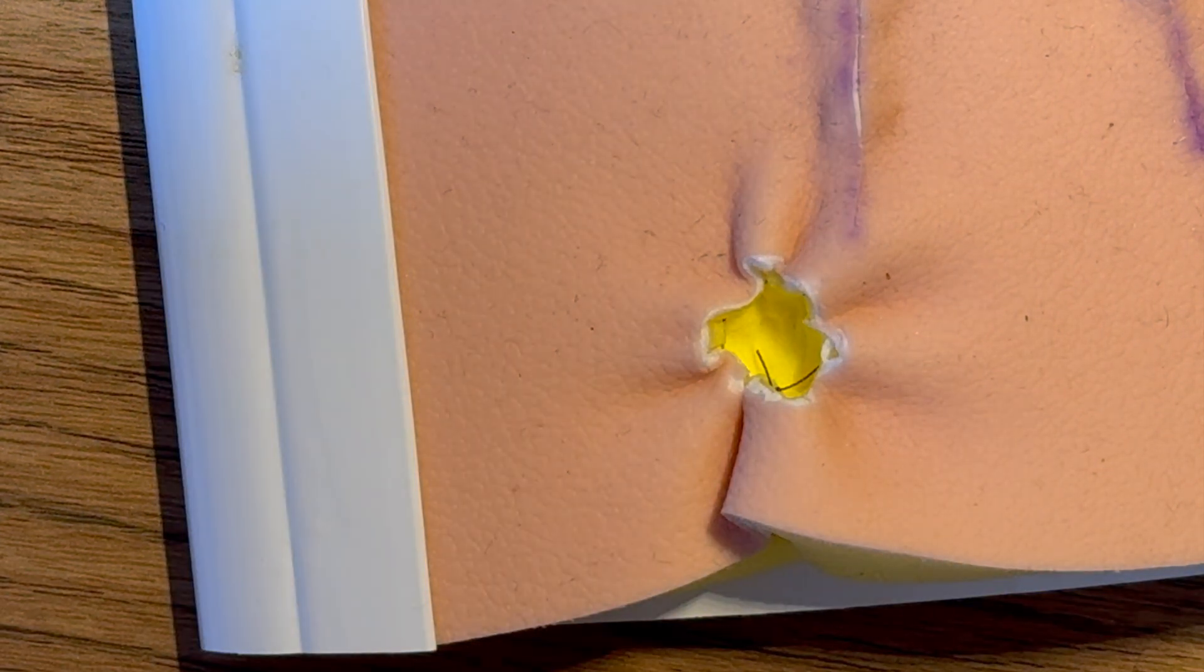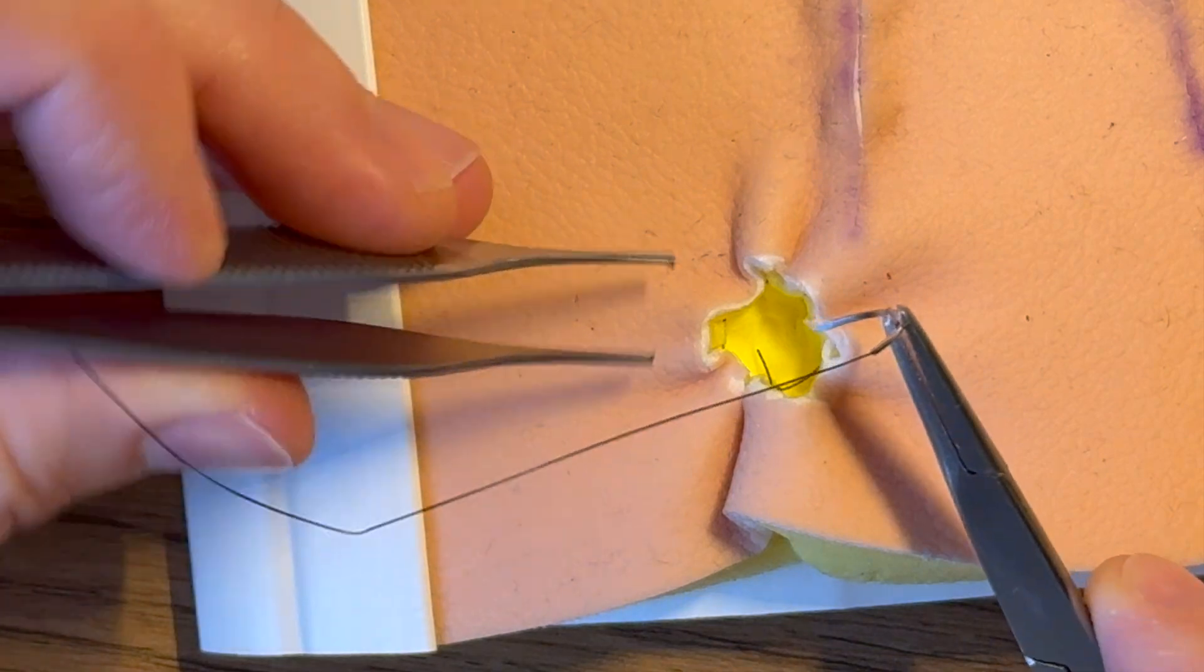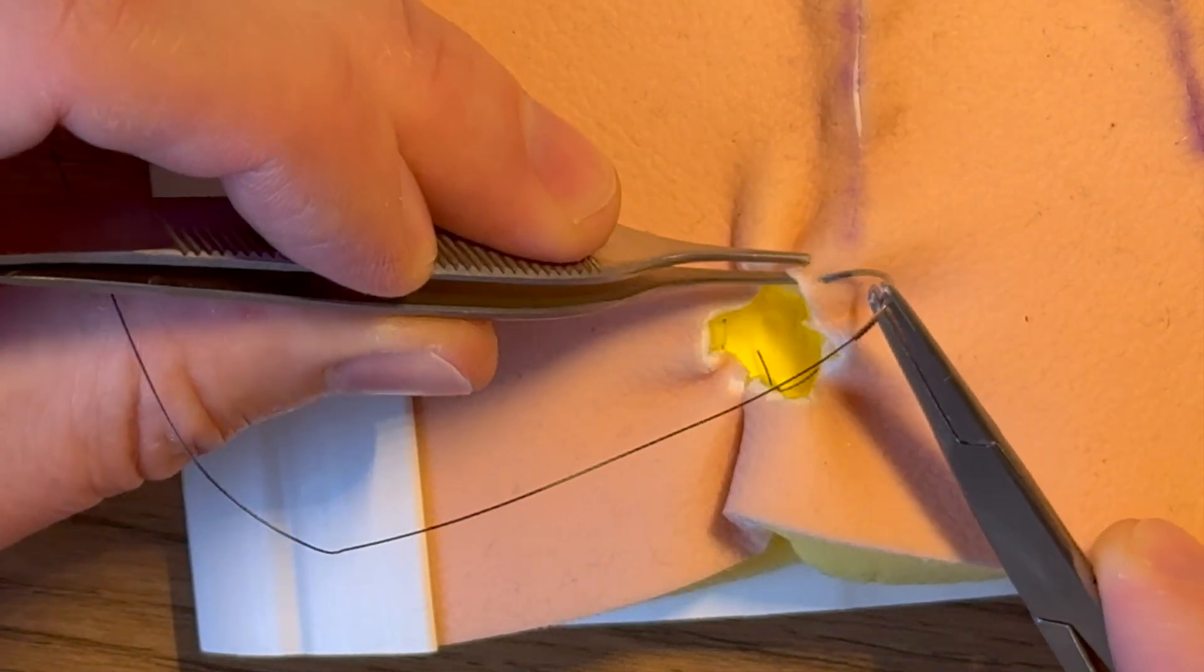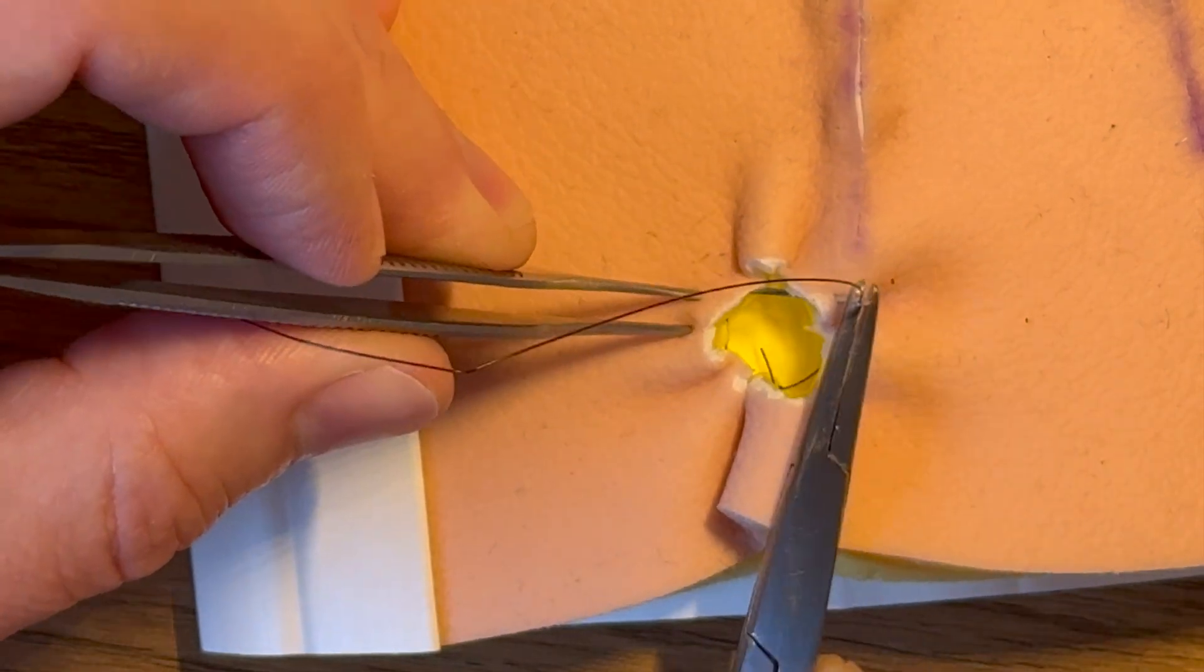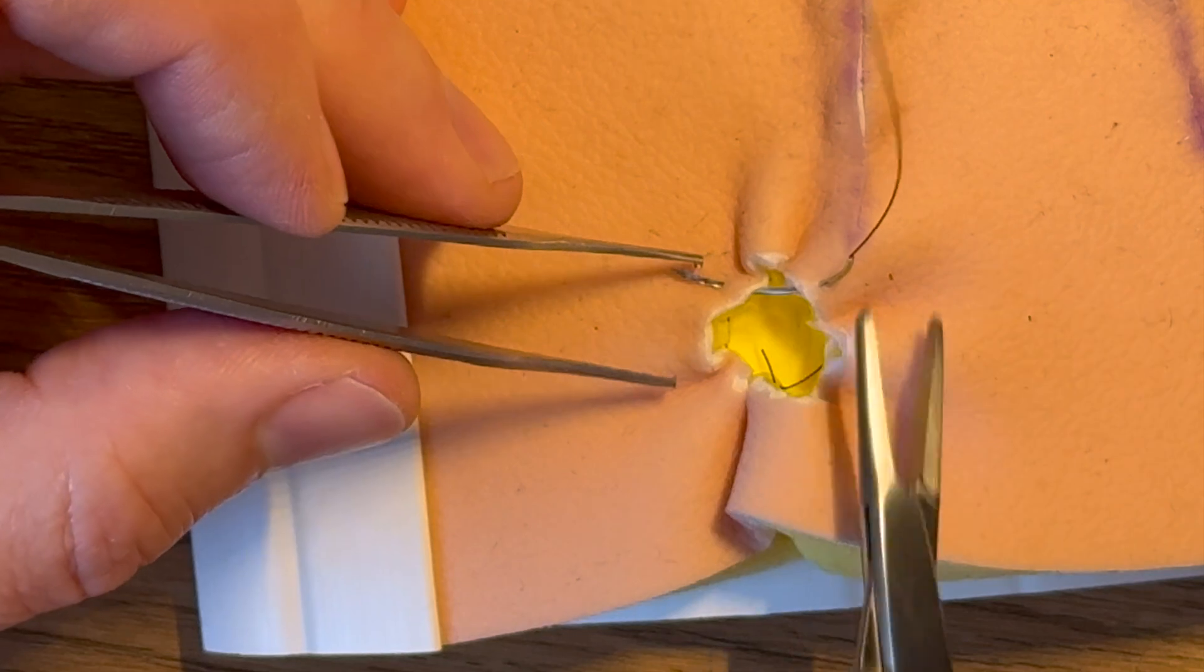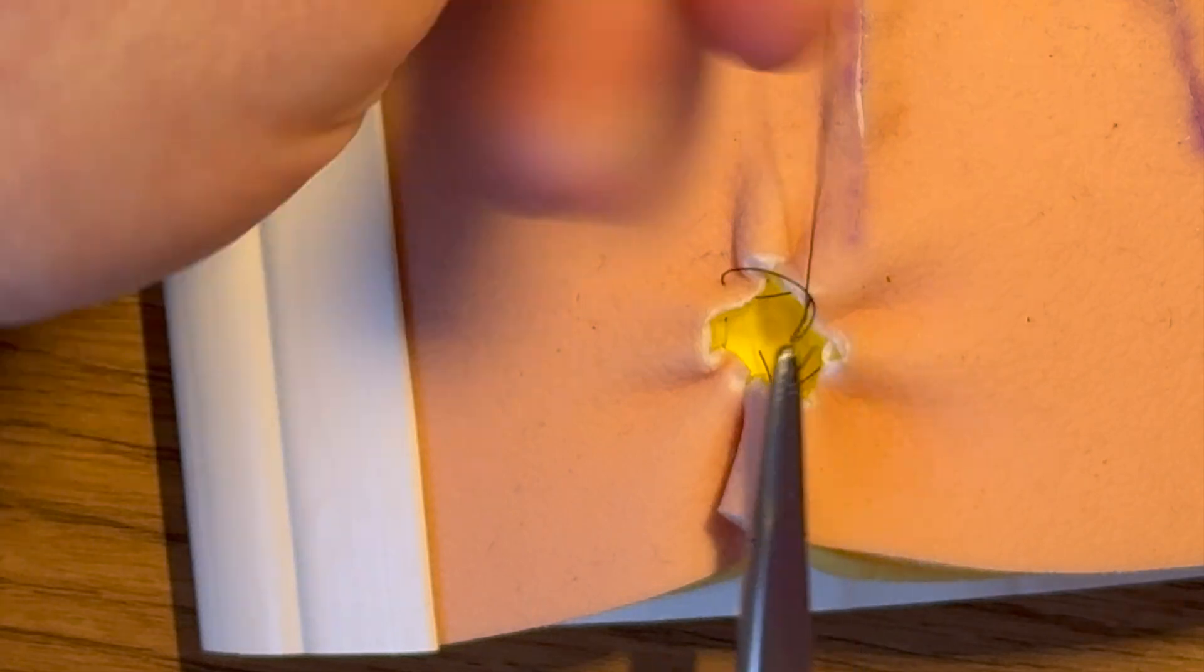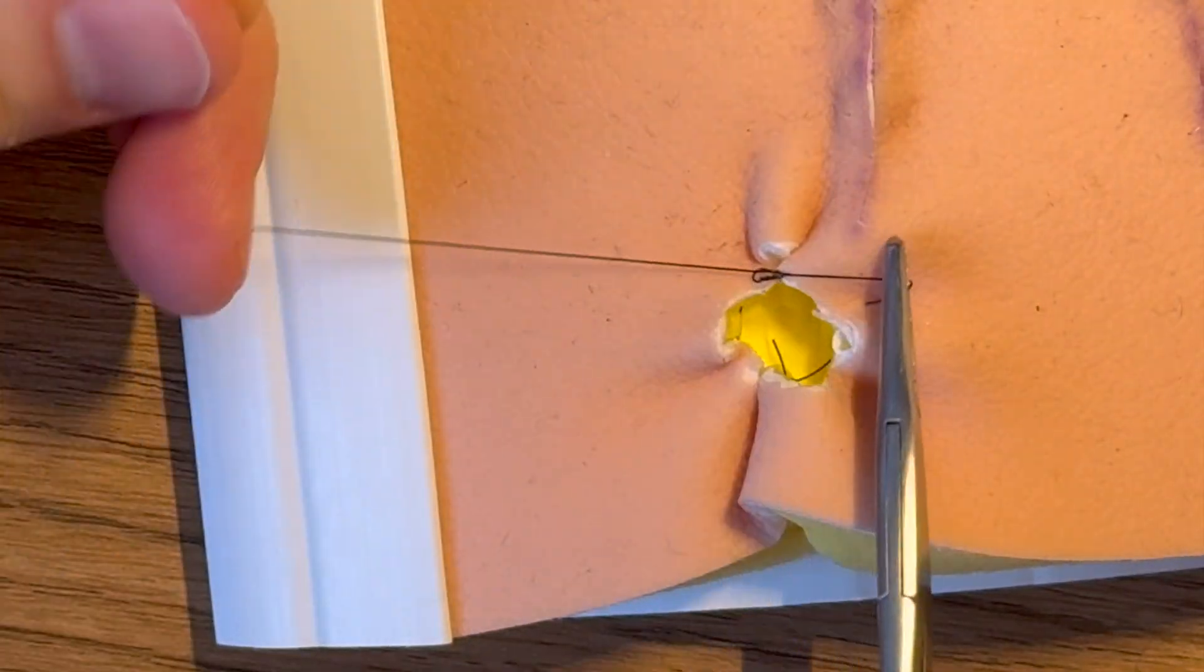So sometimes you get to this stage and you feel actually I've very very nearly closed it together and then I actually think well it's going to heal even quicker if we can close some of these little bits. So you might put a little stitch in here, bring a little stitch in, just make sure you don't collide with your purse string stitch underneath. And you might just close it a little bit more and it's still going to look odd but it's going to heal a little bit quicker.